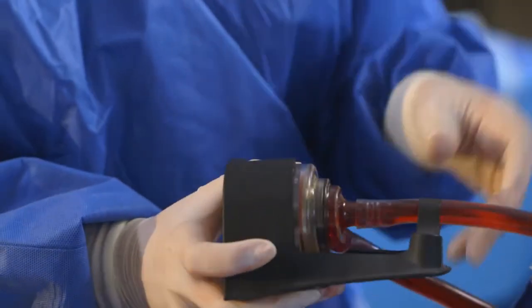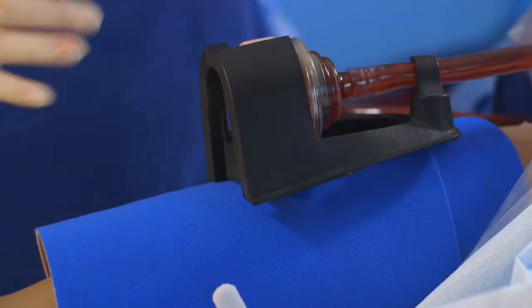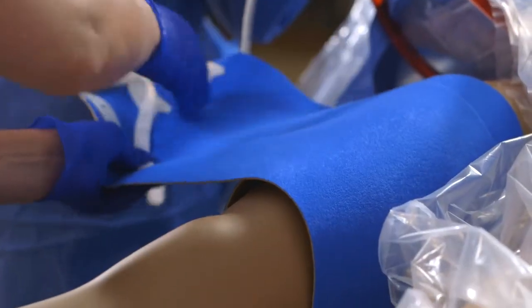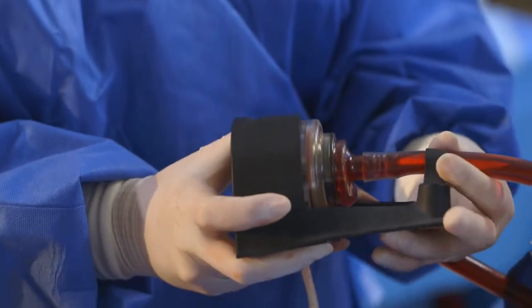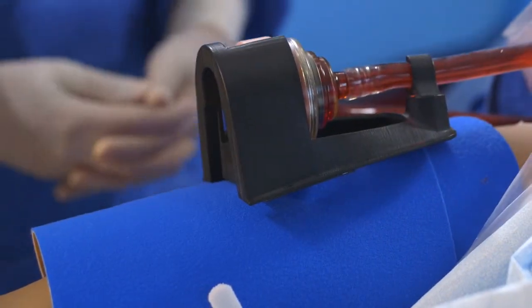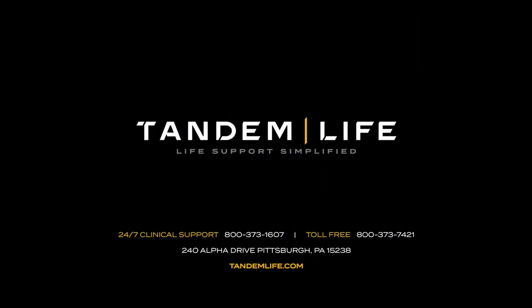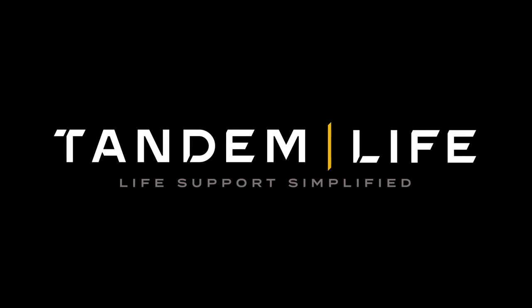Secure the pump or pump and oxygenator using the appropriate holster. For TandemHeart and TandemLife procedures, use the holster provided along with the neoprene thigh wrap for device securement. For more information, contact your local TandemLife representative. TandemLife — empowering your program to deliver breakthrough performance in extracorporeal support.